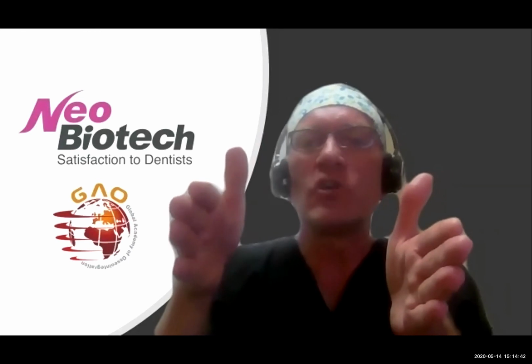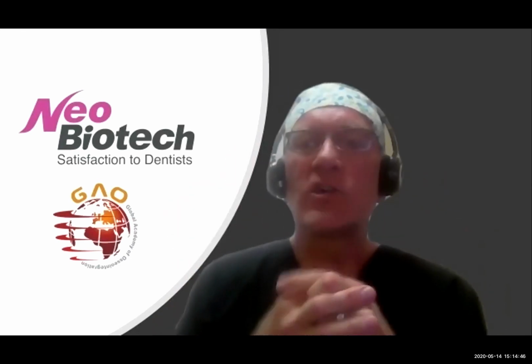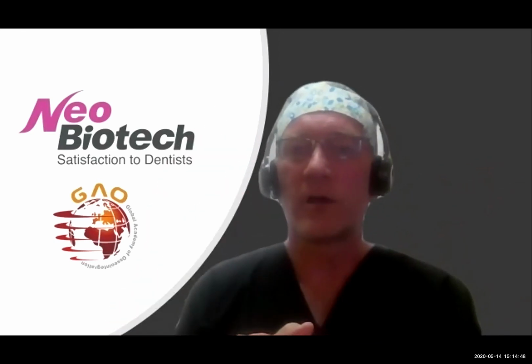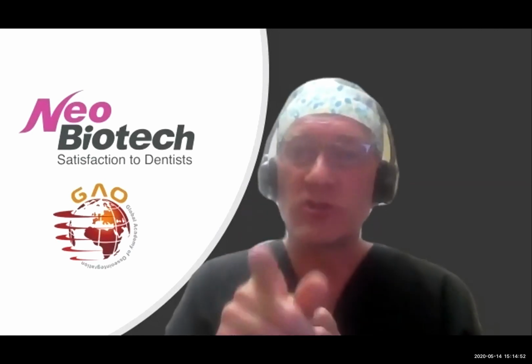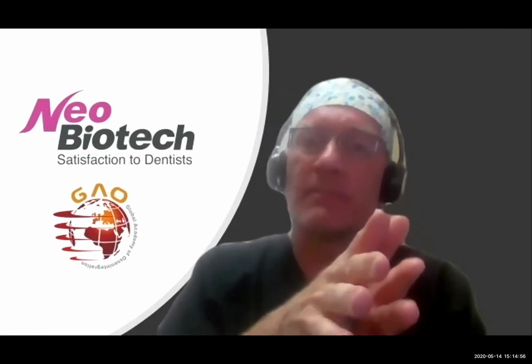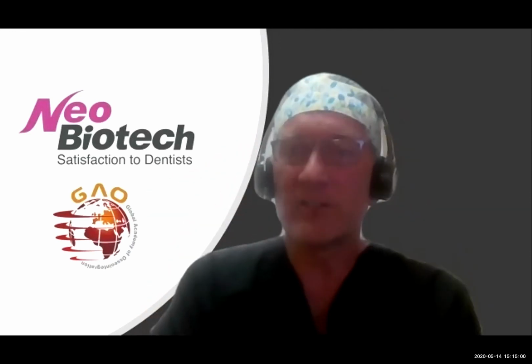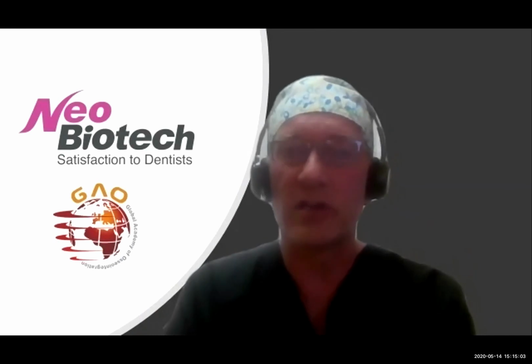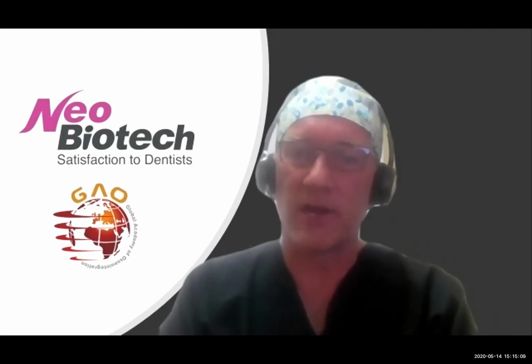And so if you want just root coverage itself, and you don't need to grow a lot of ridge there, then you could use your technique, Larry, by just placing bone underneath the periosteum, by penetrating through and getting blood supply that's coming in, and that should give you maybe 1 millimeter or 2 millimeters of bone that's there.